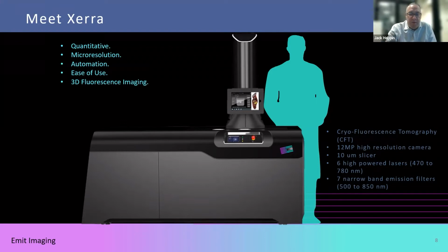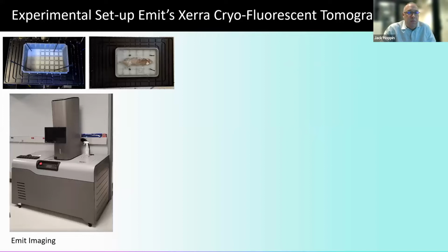So I'm going to step you through what a study looks like. There's a picture of the most recent installed system. There are different block sizes, so you can block across a range given whatever study you're running. You can put as much as you can in the block. We'll talk about that later. And your block size will change the reconstructed resolution of the system.